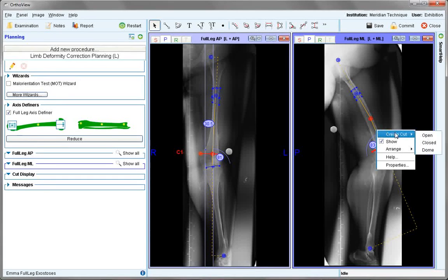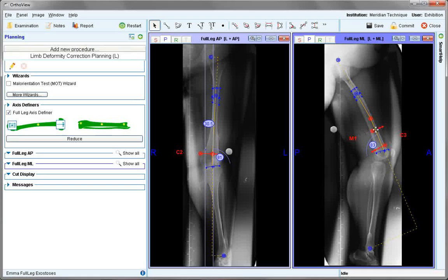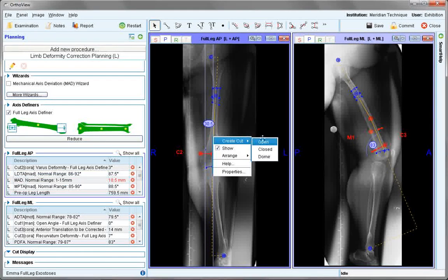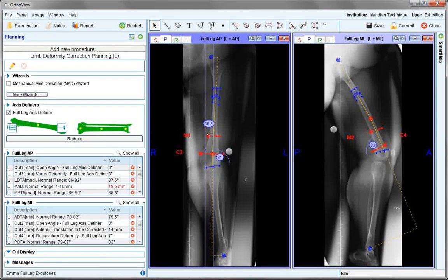By right clicking, a manual cut can be obtained and this is highlighted as an M cut — M1 in this case — and also positioned closely against the cortex. This can be done in both views. Both the CORA and manual cuts should correspond on the anatomy as closely as possible.